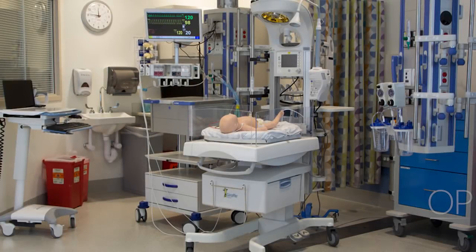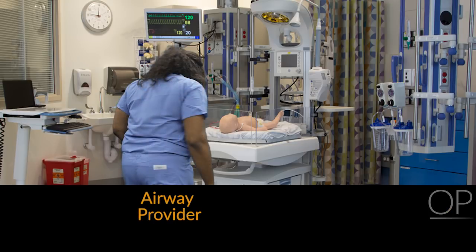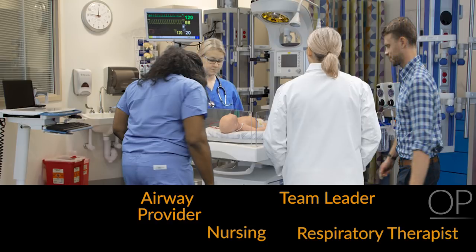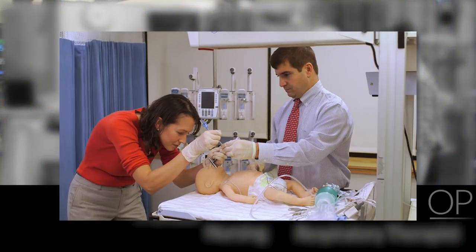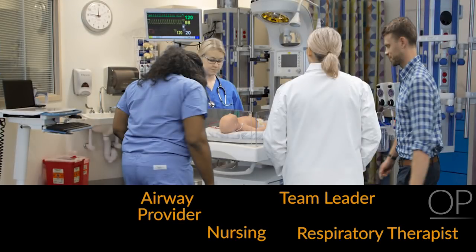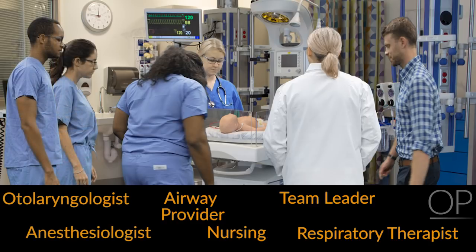Ensuring the appropriate personnel are present is a critical step in the success of the procedure. The intubation team members may include the airway provider who performs the intubation, and a team leader — ideally identified separately from the airway provider. Nursing and respiratory therapy should also be present. It is important to clarify responsibilities, including who will hand the endotracheal tube to the intubator, who will secure the tube and provide positive pressure ventilation, and who will observe vital signs and alert the intubator of any significant change. In cases of known or suspected difficult airway, an otolaryngologist or anesthesiologist with training in pediatric advanced airway techniques may be beneficial.